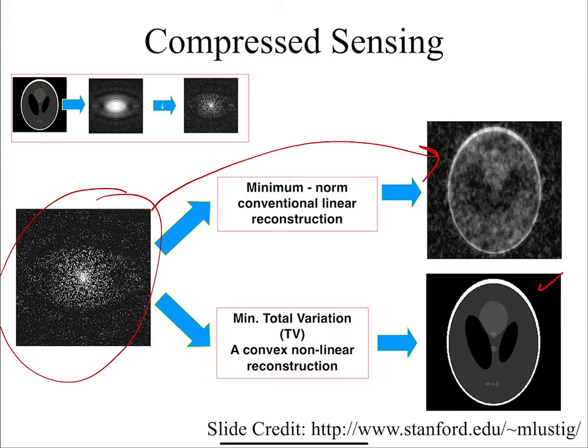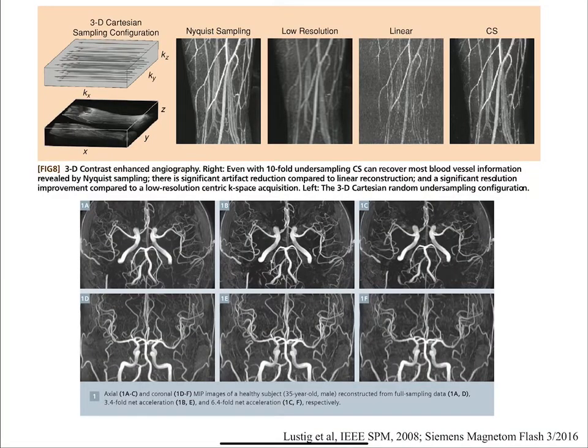Okay, question. Why would you want to do this? What is the advantage? Speed. It's all about speed. It's basically getting the subject in and out as quickly as possible. For example, one of the first groups to really push this was a group that did pediatric imaging up at Stanford, and there the idea is, if you have a kid, you know they can't stay still, right? And you don't want to sedate a kid for standard imaging. And so basically, the faster you can go, there's a trade-off, right?